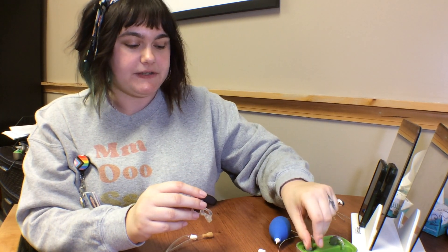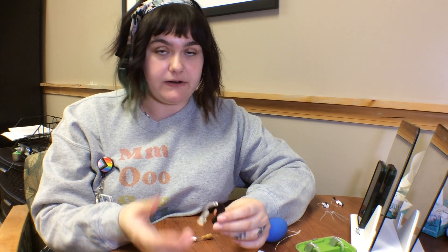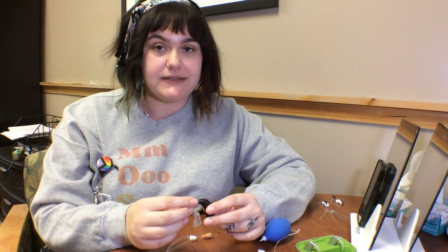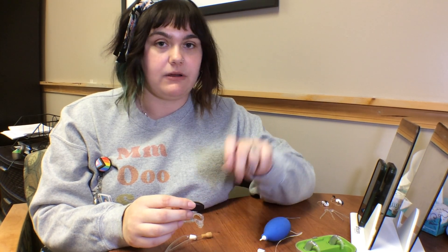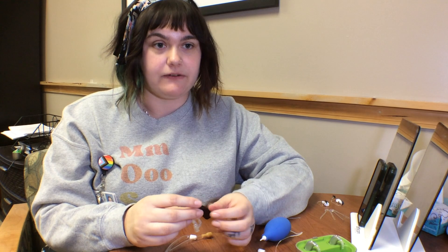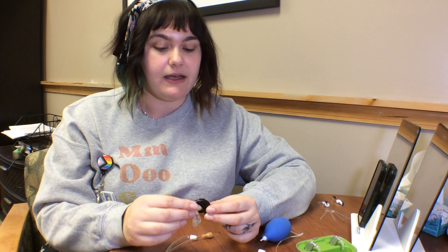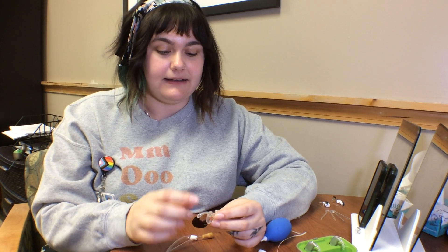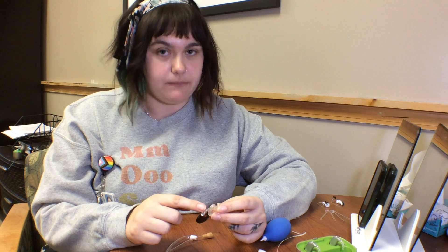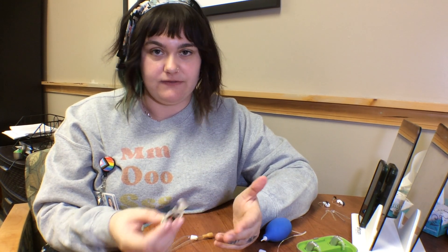The very first thing that you're going to want to do with this type of hearing aid is when you first turn it on, if no sound is coming out of it, you want to either change the battery or put the hearing aid in the charger for at least 30 minutes to check if it's a low battery problem. After that, we want to systemically try all of the different parts to make sure there's not something wrong with each individual part.